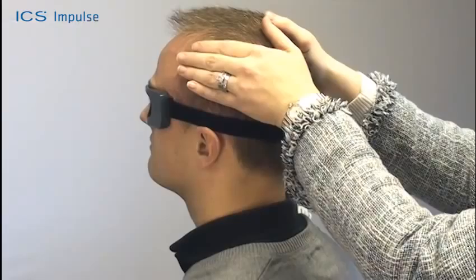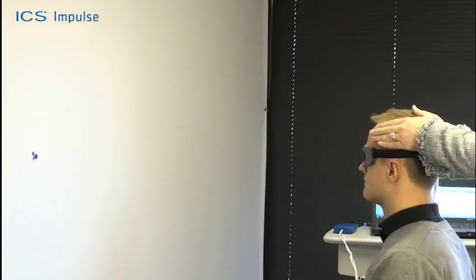A head impulse is a quick movement of the head which stimulates the semicircular canals. The patient fixates on a dot during the head movement. The ICS impulse goggles measure the head and eye movement. The response is that both eyes turn to correct for, or compensate for, the head turn. This compensation keeps the patient looking at the target as the head is turned.